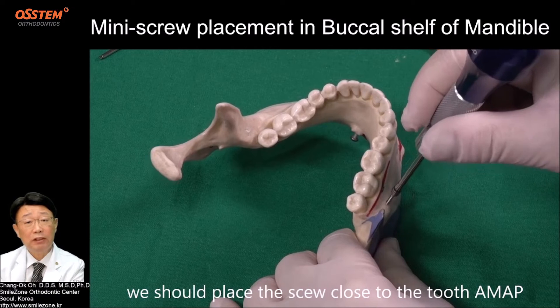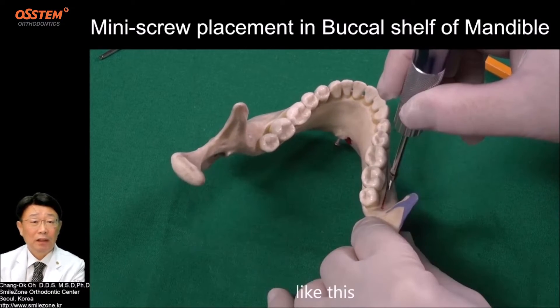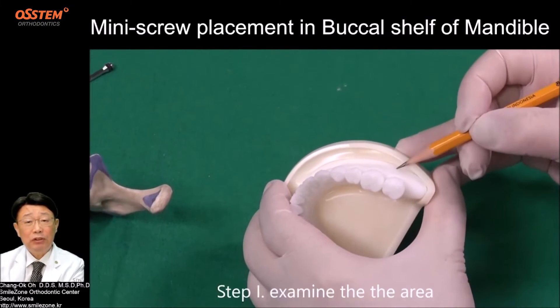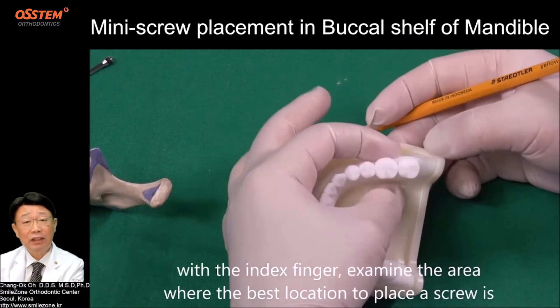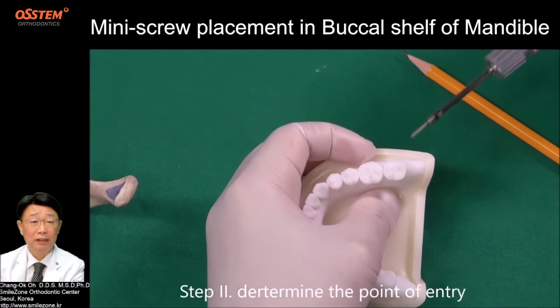We should place the screw close to the tooth as much as possible. Let's take a look at the procedure step by step. Step 1: Examine the area. With the index finger, examine the area to find the best location to place a screw.